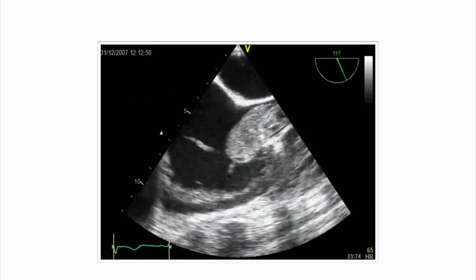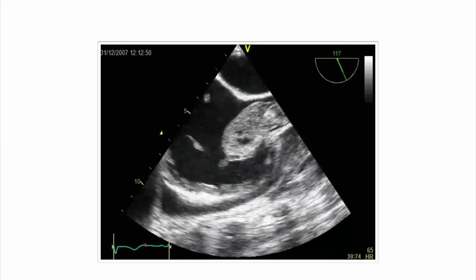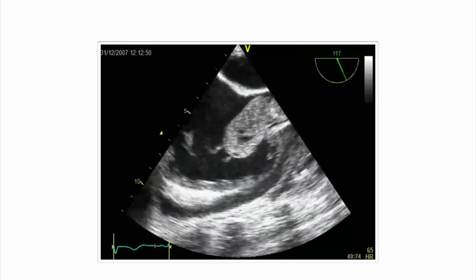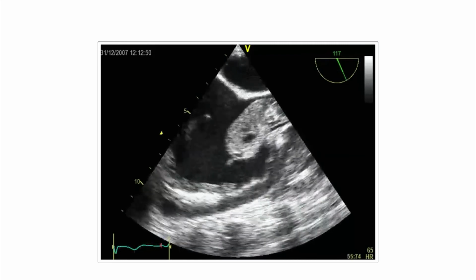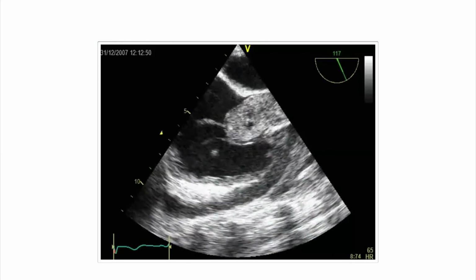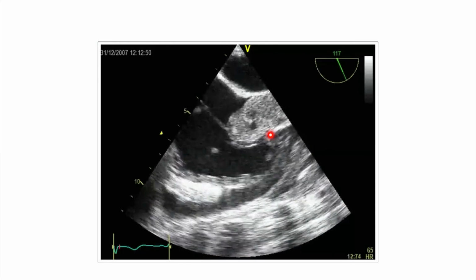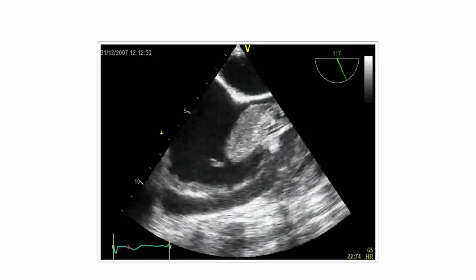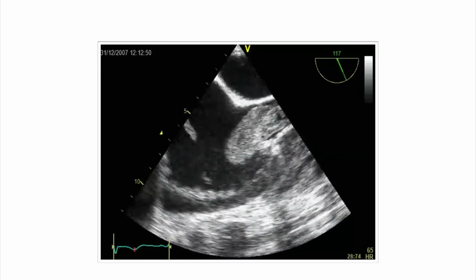And sometimes we find rather surprising findings, as this huge thrombus coming from the SVC in a patient who developed pulmonary embolism. No wonder why the patient has pulmonary embolism. Obviously, parts of this thrombus have dislodged. Now, the reason that this patient had the thrombus was that he had a central line catheter in place and that he had a coagulation disorder.